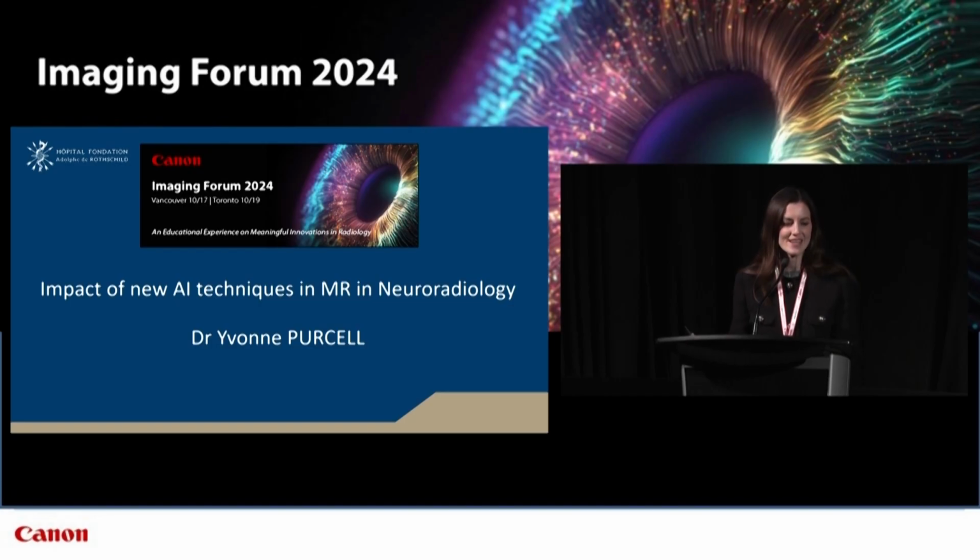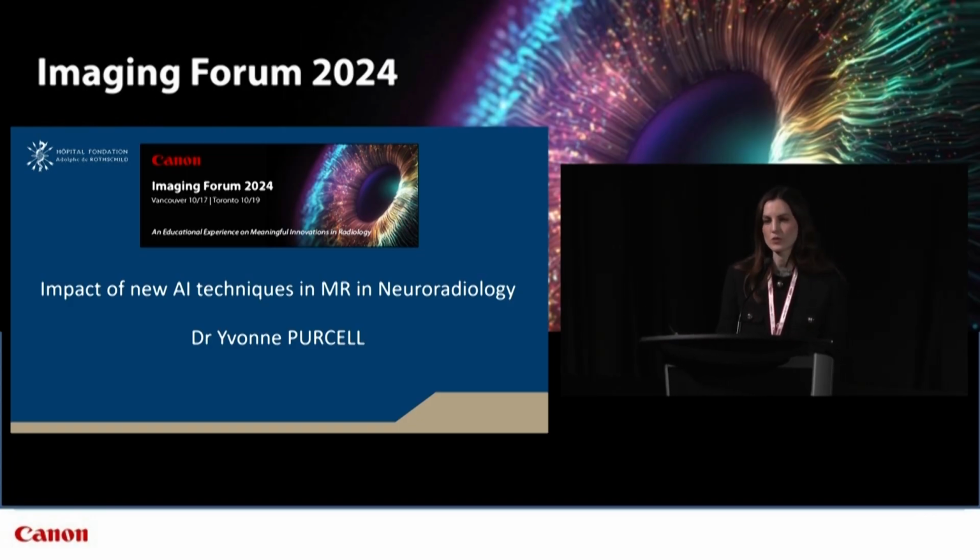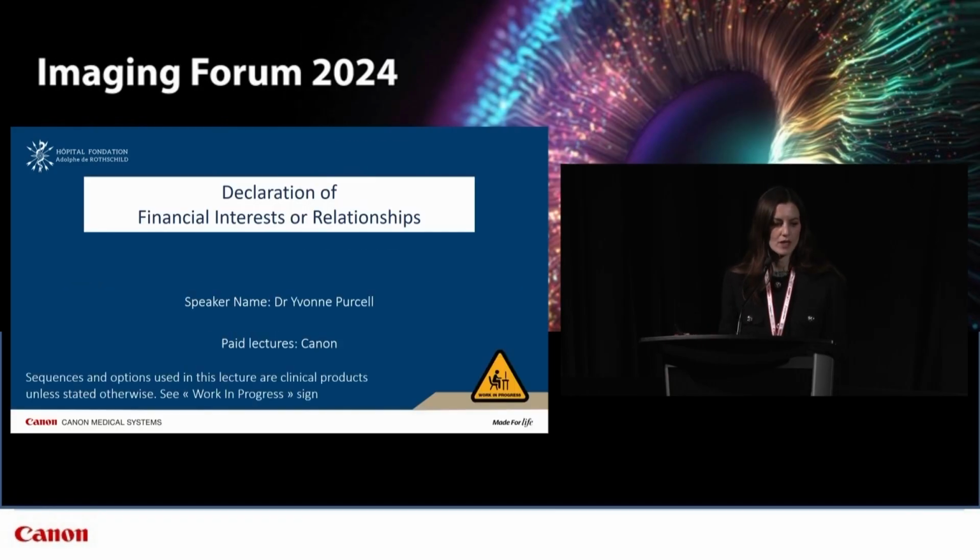while I'm presenting. And please bear with me while I show you some nice examples of MR utilising Canon's AI algorithms from our Neuroradiology department in Paris. Here are my disclosures. Sequences and options used in this lecture are clinical products unless stated otherwise, and you'll see this work in progress sign.